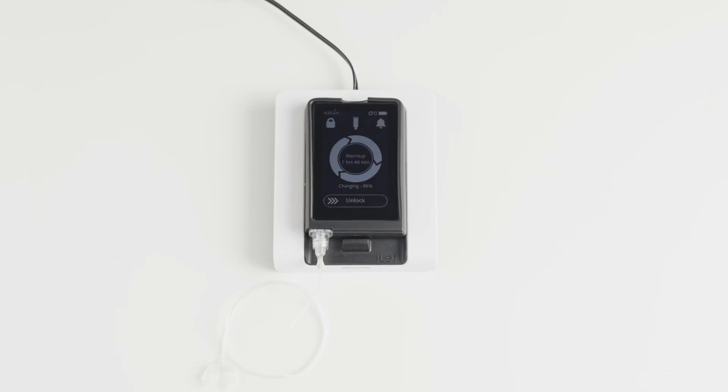We recommend charging your eyelet for a few minutes each day to make sure your eyelet always has enough charge to work and to get the most out of your battery's lifespan.